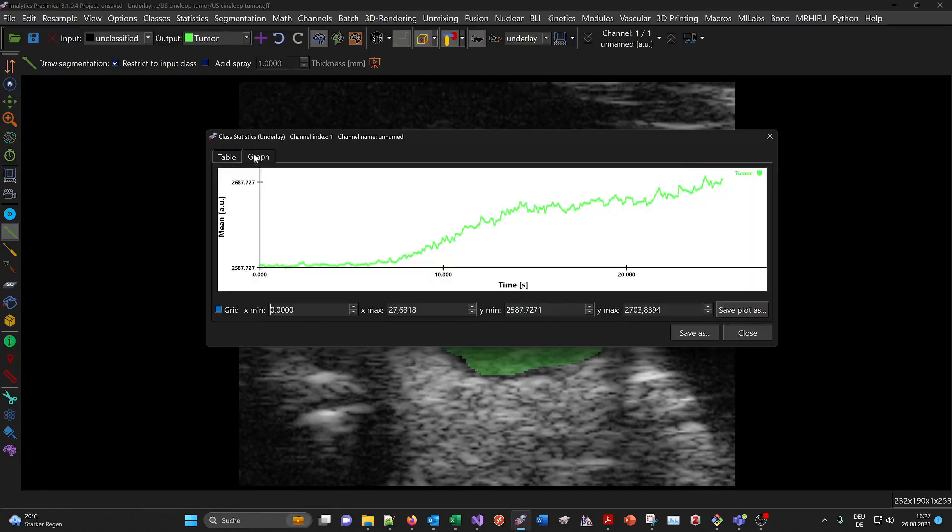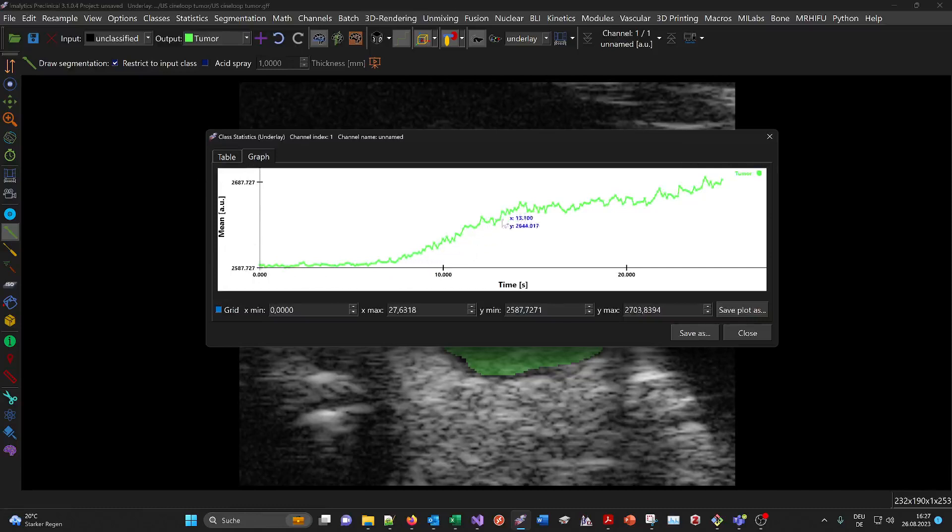Here you see a graph. This is the flat phase at the beginning, then at some point the microbubbles reach the tumor and enhance it in brightness, and then there's a plateauing phase.